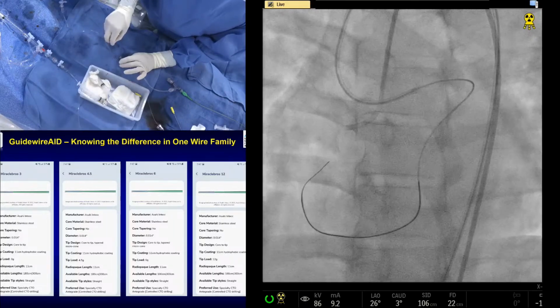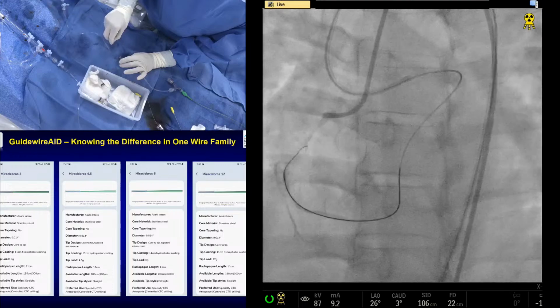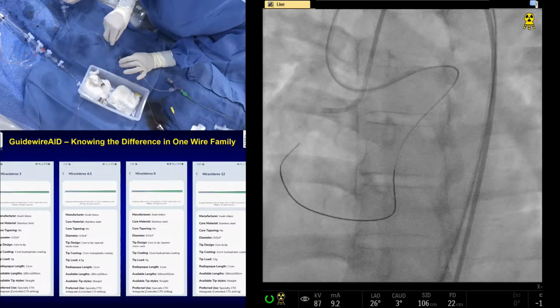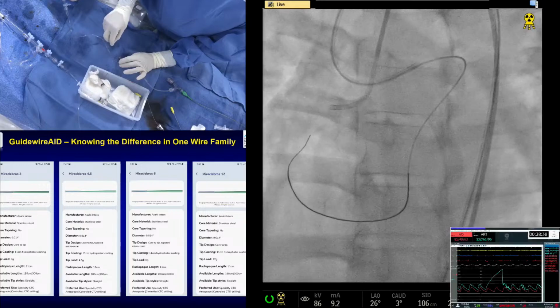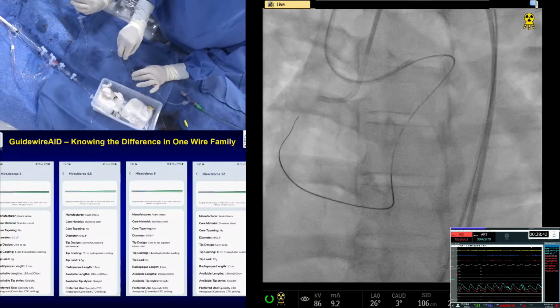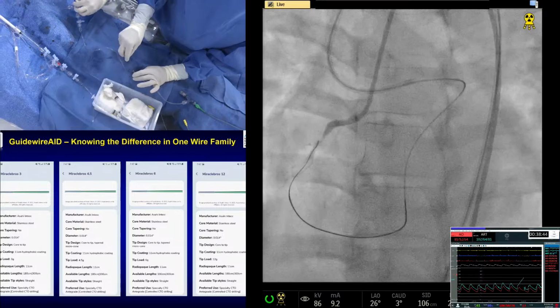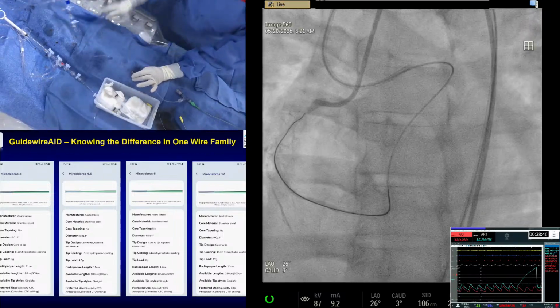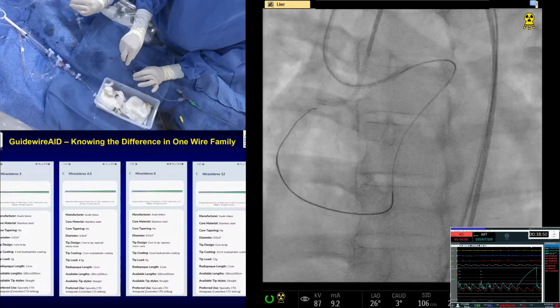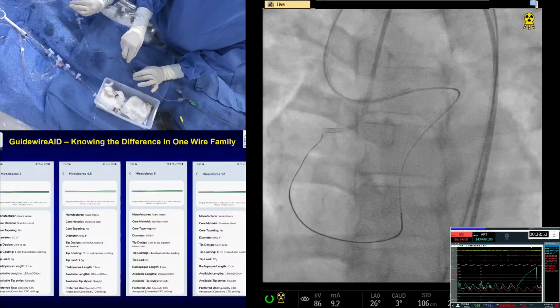Your little dye antigrade, right? Looking good. And then the radiation reduction, that shield which they are putting on the patient's chest wall and all those things. So all those things help to decrease the radiation further. And most importantly, the newer machines. Our newer X-ray machines are very, very good.